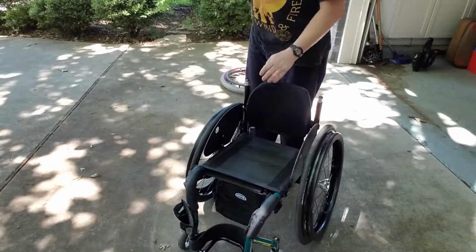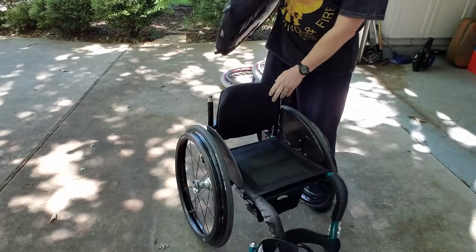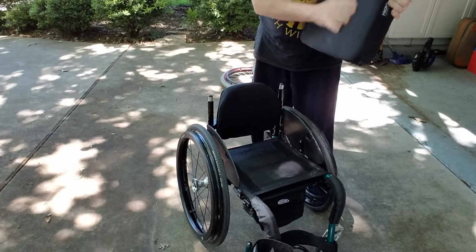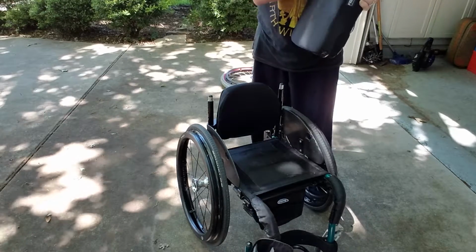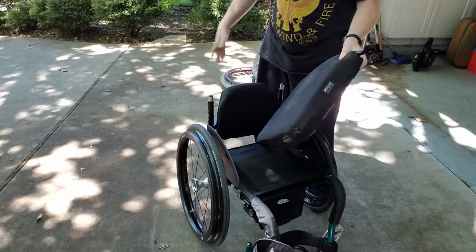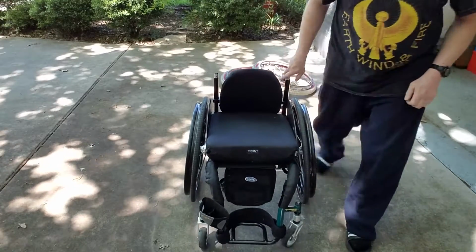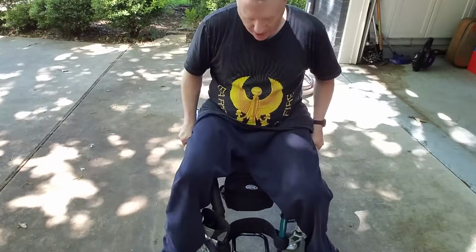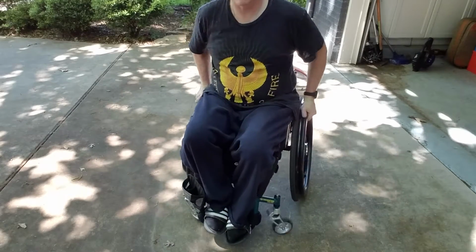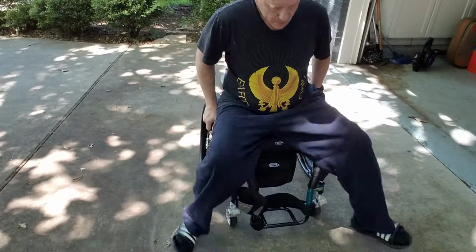A lot of times when you're doing this, the cushion might fall off. Well, get back here. There are no brakes on this, by the way. Like a standard wheelchair, there's nothing to lock the wheels in place so it doesn't roll away on you. So when someone's putting this together, you need to be aware of that so it doesn't go rolling off down the street or something. And now you put the cushion in, and you're ready to roll. Obviously this isn't sized to fit me, but you can see how you would put your legs in here and you'd be ready to head out or whatever.